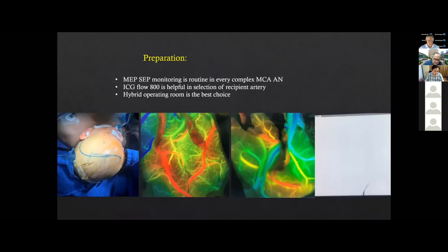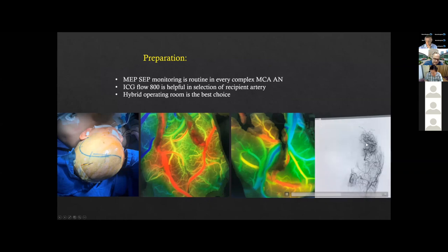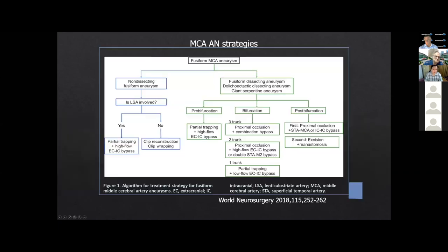For preparation, MEP and SSEP monitoring is routine in every complex MCA aneurysm. ICG flow 800 is helpful in selection of the recipient artery, and the hybrid operation room is the best choice. This is the intraoperative angiogram. We can see the distal bypass with blood flow returning to the M2 segment.